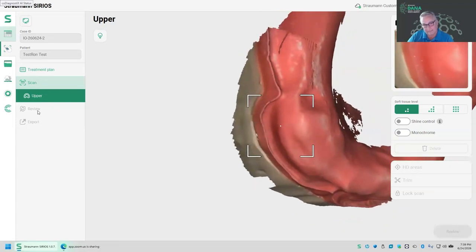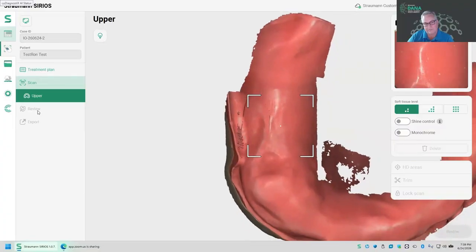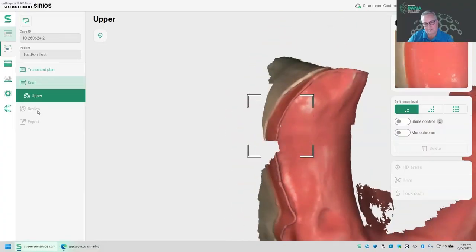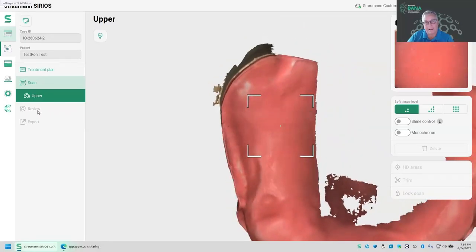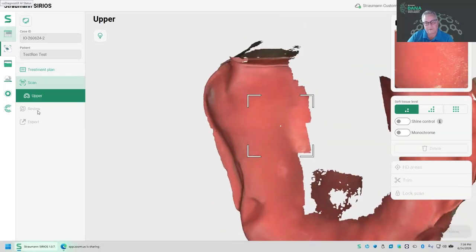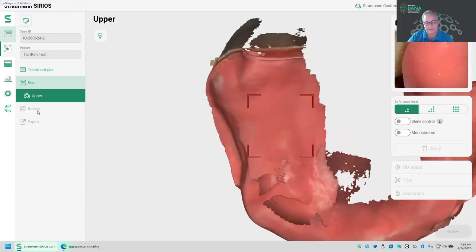Oops, I'm seeing a little bad data building there. Let me come back to my occlusal, fix that. Okay, turn to my facial, overlap, and continue my facial pass. All right, now we want to just rock to the palatal side of the arch. Okay, and come around the arch. Whoops, same thing, same issue.